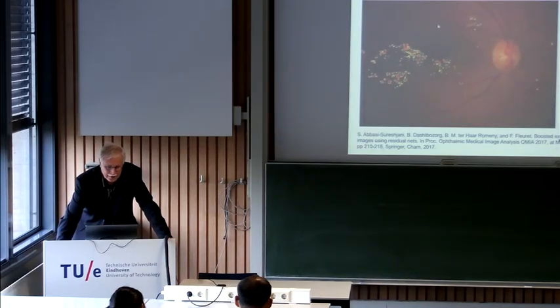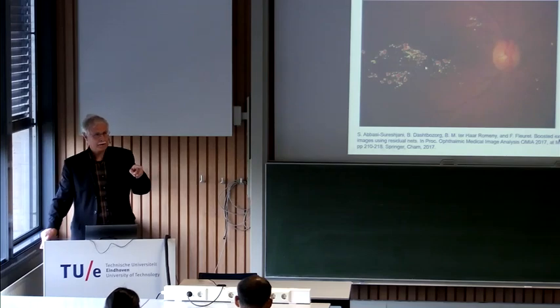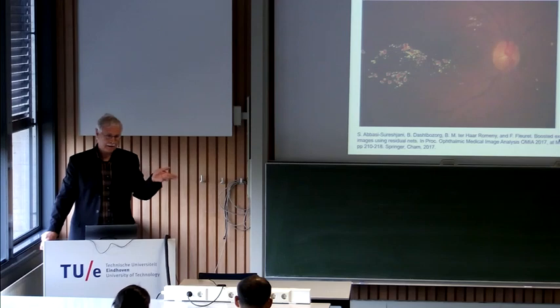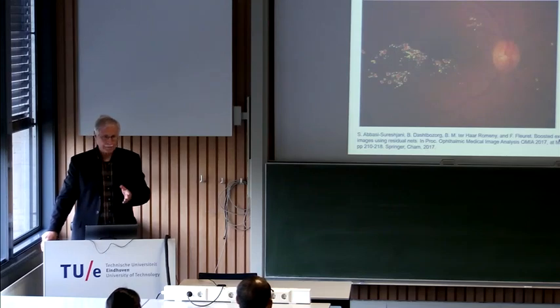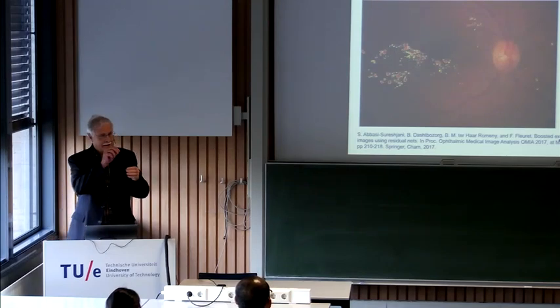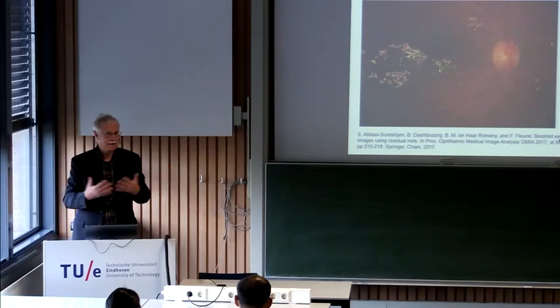Samane worked on the detection of exudates. And this is a very nice breakthrough, because if you find the exudates here, and the neural network did a pixel-wise classification, so we could see from a pixel, okay, this is a two-class decision-making. It is either an exudate or it is a normal pixel. So for every pixel, that decision was taken, and now you see nicely. But to validate how this works, what you actually need to ask the doctor is circumline all these small areas and check if the ground truth is what my computer says.